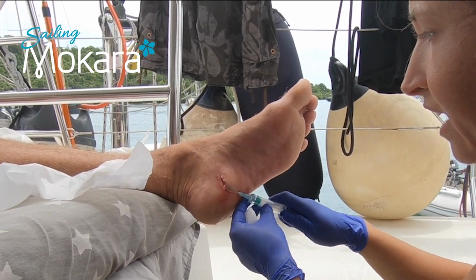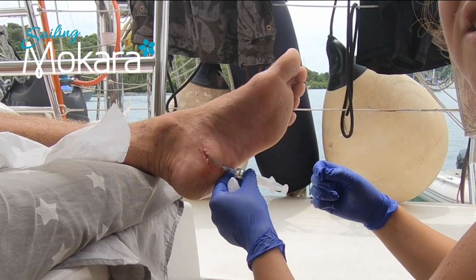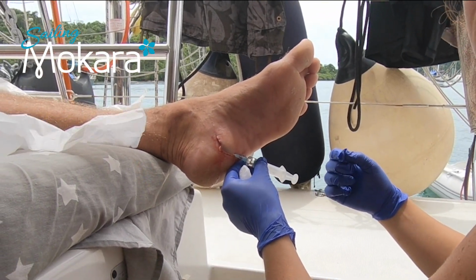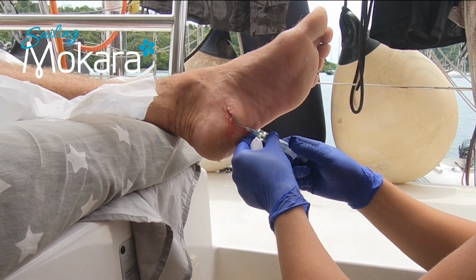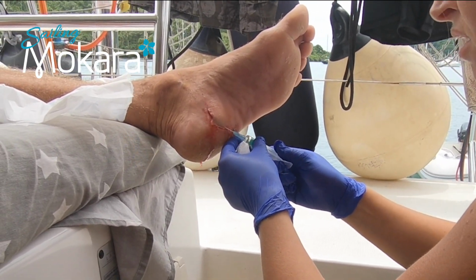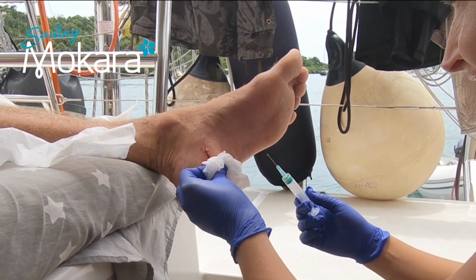Oh, you're sticking it out the other side first. At this... No, it's not good. Yeah, you want to see that it's not in a vein or an artery. No, in an artery, sorry. I think it's coming out the cut there. Yeah, it's normal, sometimes it comes out everywhere.